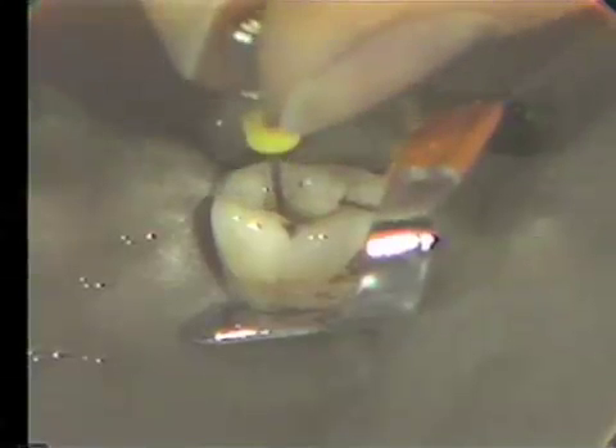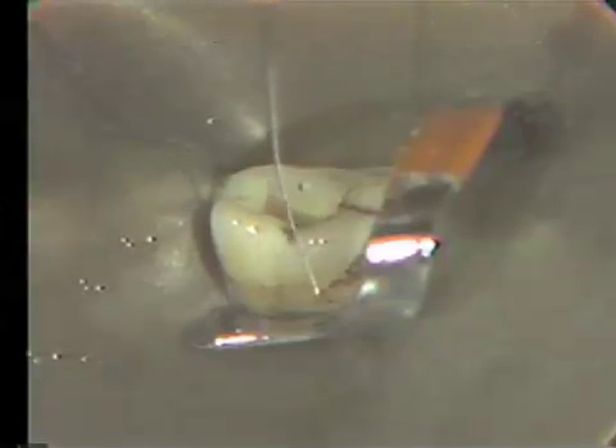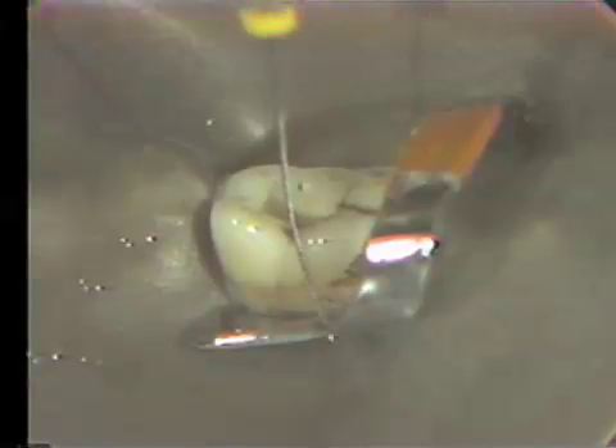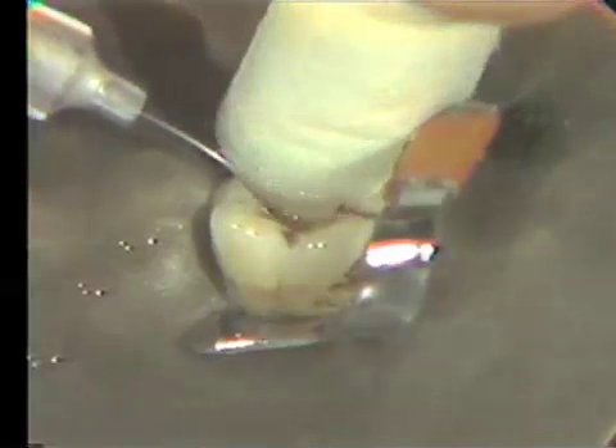In the tooth, I have a number 20 file, and I've instrumented it just about the way I think is necessary. It fits fairly loosely in the canal — it can go up and down. Now pull the file out. Can you see how this file is bent? If you're working in a curved canal, you always work with a curved file. If you go down with a straight file, you'll be in trouble right from the beginning, no matter what size it is. So you curve your file and try to match it to the curve of the canal that you're working in, and then keep it in that direction. Let me put some sodium hypochlorite in the tooth, flood that, wash out any debris, and then we'll go to the 25 file and show you what happens.